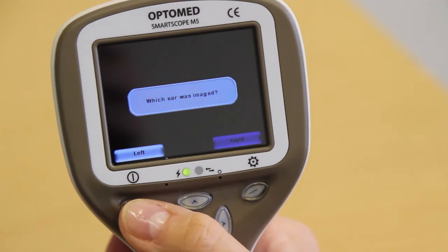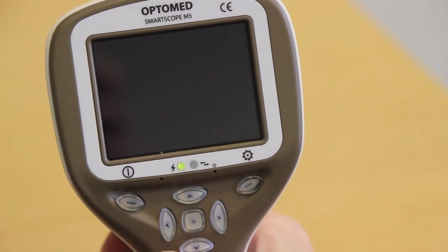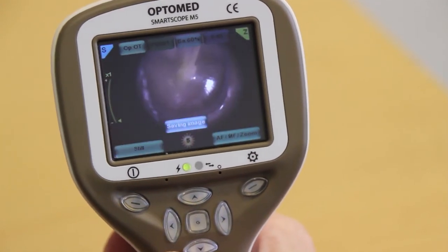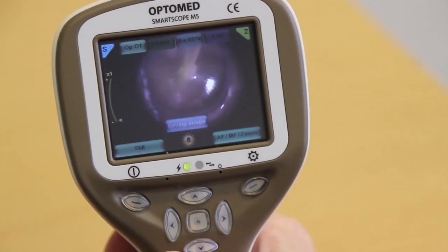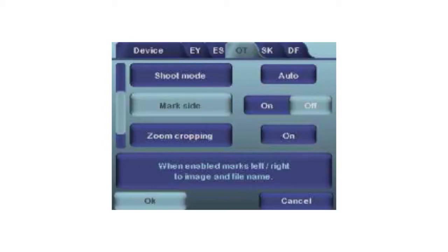Mark side: after each image, it is possible to mark which ear was examined on the image and the image file name. Marking side feature is available in the OT menu.